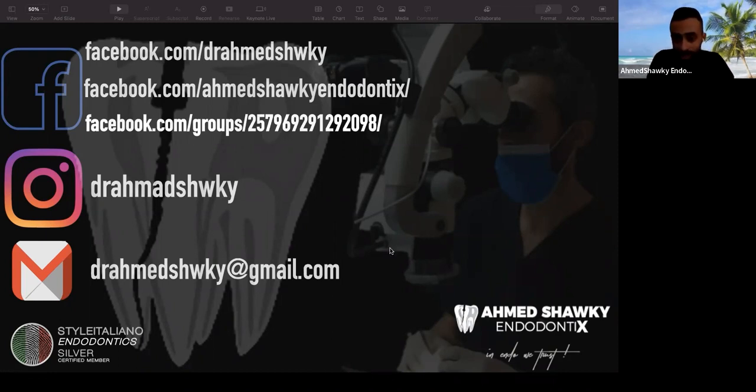Shall we terminate the instrumentation to the 0 point or 0.5? That's a controversial issue. For me, there are 2 points in this question. I shape to the 0 to exclude any possibilities of leaving pulp tissues. I instrument the root canal, shape the root canal to the 0. But when I obturate, I perform gauging. Gauging allows you to put your master cone at the minor diameter.